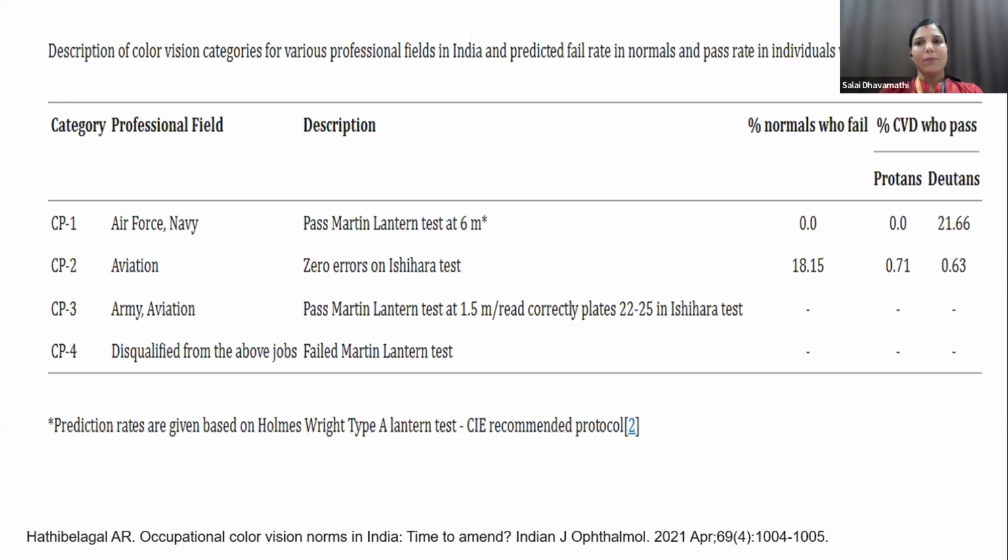So one thing is important, how do we check color vision in children? For them also, you can give some matching cards or matching shapes, and then ask them to match and say what color it is. Okay, teach them with the shapes. If the child is visually impaired, you can teach them with the shapes, because with visual impairment, color vision is also impaired.